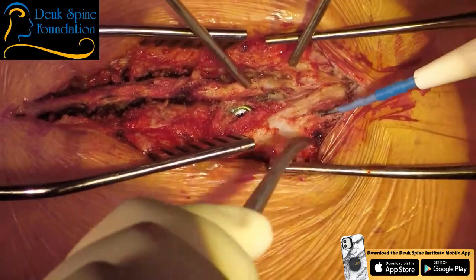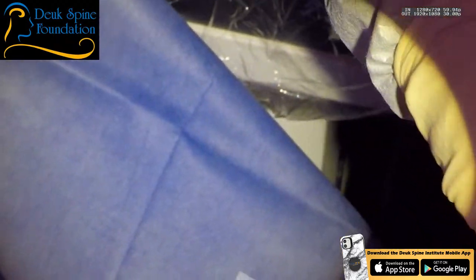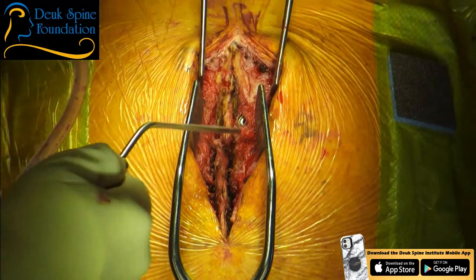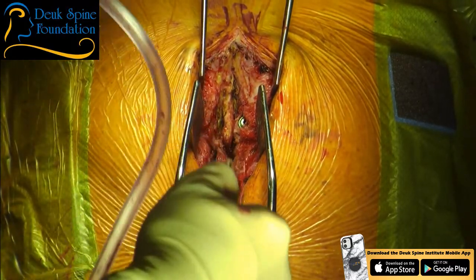And now, normally, when I do surgeries like this, I go pretty lateral. Let's just verify. Do we have, that's our x-ray picture there. So we've got our screw at the level above the kyphoplasty. And based on the MRI, this is the level, and the one above it, really, it's more T10, T11, right? Where we need to focus. Yes, sir. Let's go back to that MRI and scroll it for me. You don't need to go back, Sean. I want you to stay on the field. But I just want to make sure we're doing everything right.